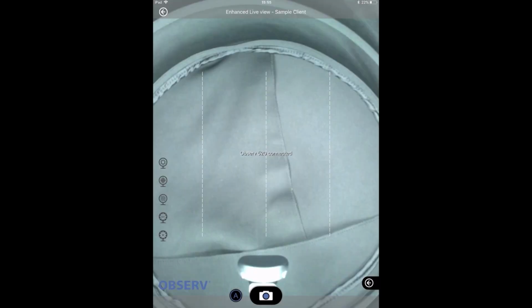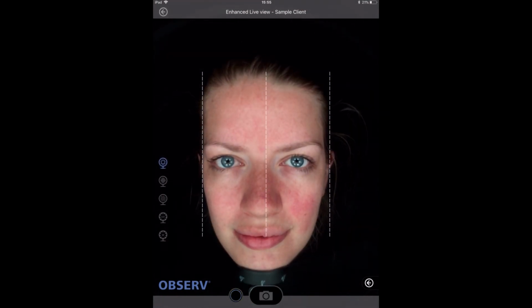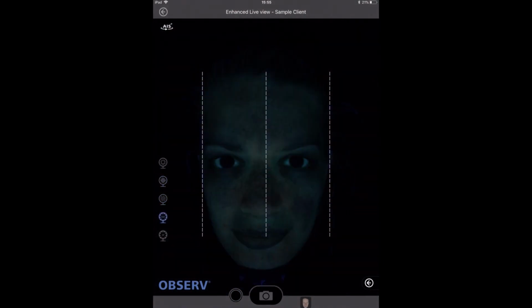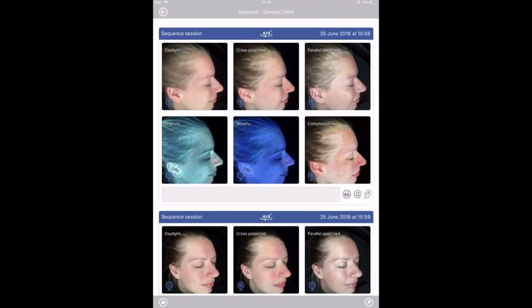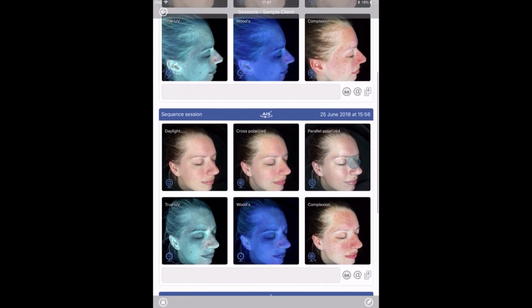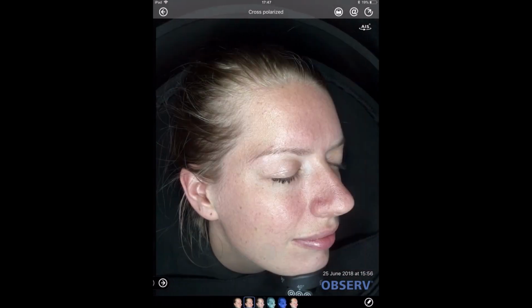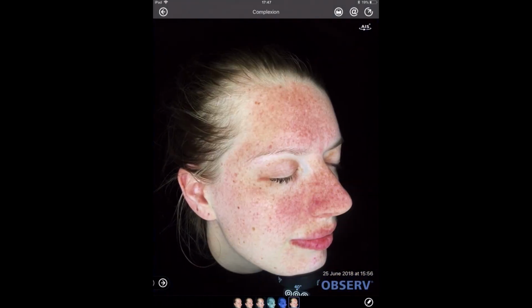the live view. You will see that as soon as a face is detected in the live view, the AIS logo will appear in the upper left corner of the live view, which means that the AIS configuration is activated for this session, giving you access to the exclusive app features, face notes, and dynamic reporting. In the sessions view, you will also see the AIS logo in the upper bar, and in the picture view you see the logo in the right upper corner, which again indicates you can use face notes on these pictures.